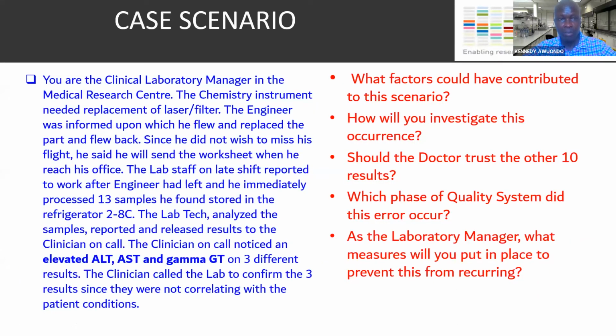To start with, I will begin with a case scenario, which we shall discuss together at the end of this presentation. Here's the case scenario. You are the clinical laboratory manager in a medical research center. The chemistry instrument needed replacement of a laser stroke filter. The engineer was informed, upon which he flew in, replaced the part and flew back.